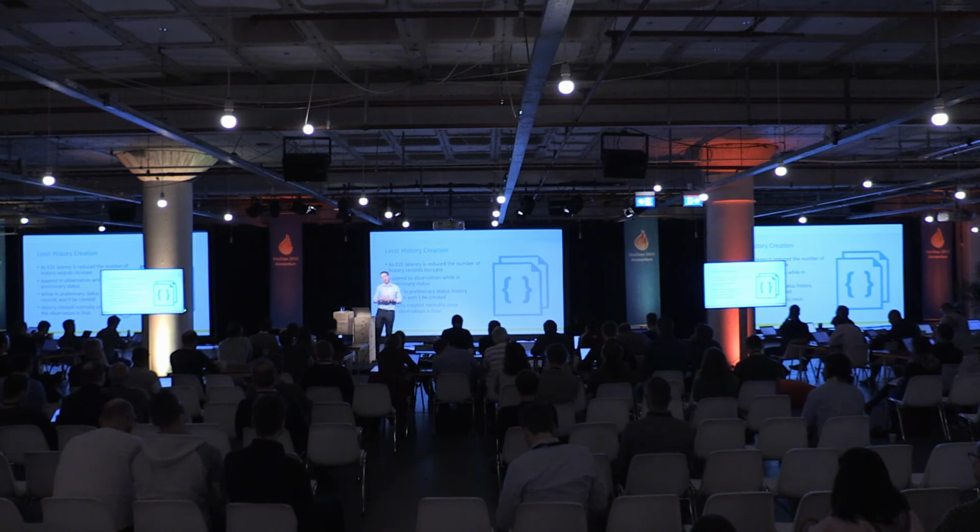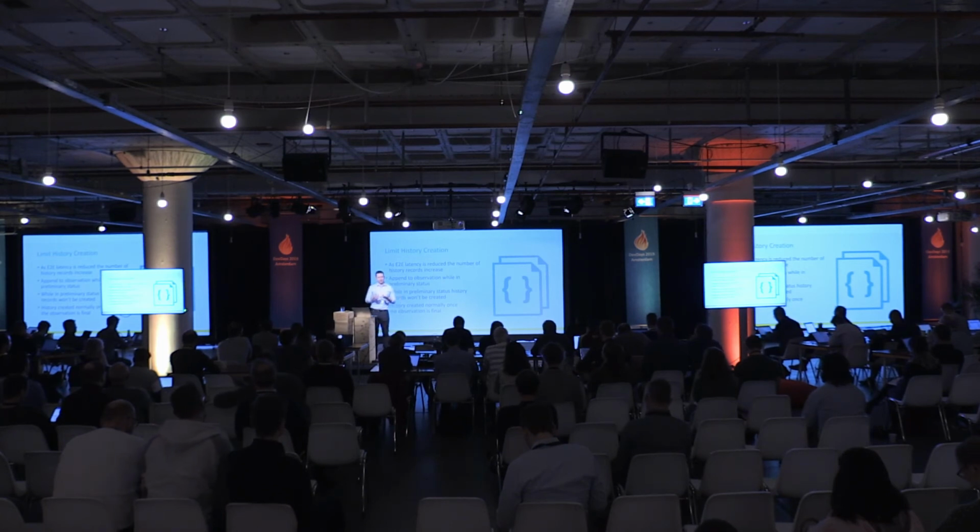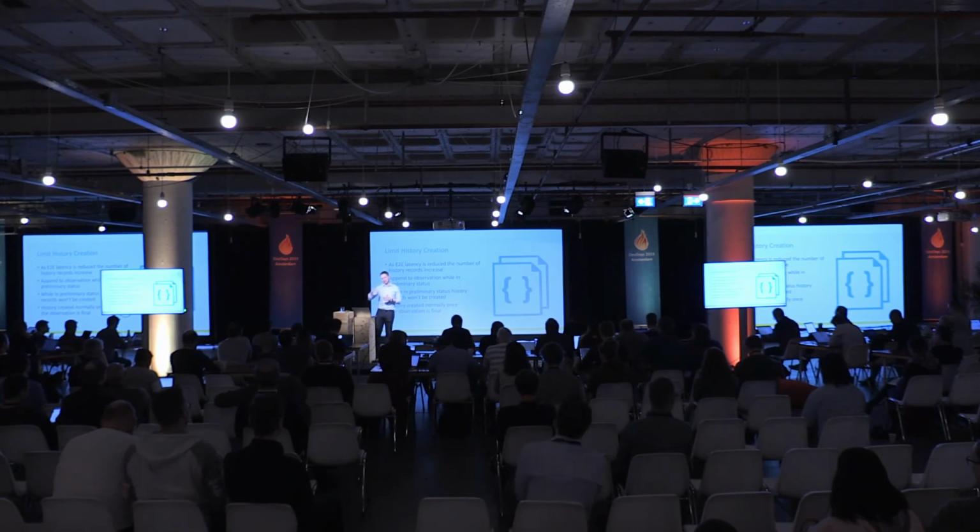This will allow you to hydrate out the data stream as time goes on. And then once you're at a point in time where you want to seal the data stream and say that this observation is final, then from that point on, the observation is in the final status, and history would be maintained normally.